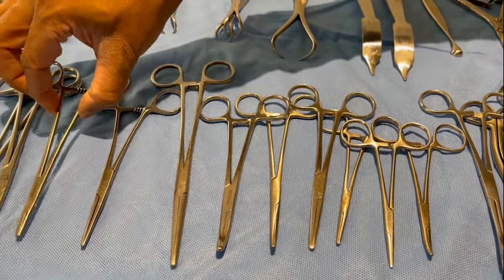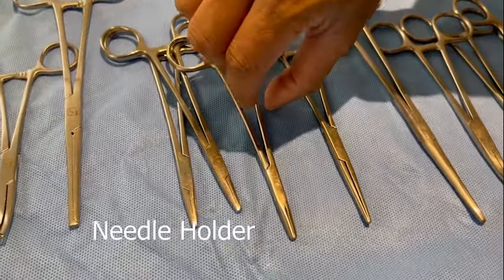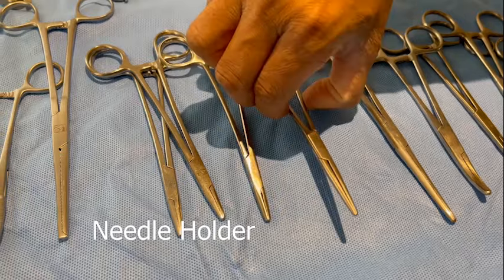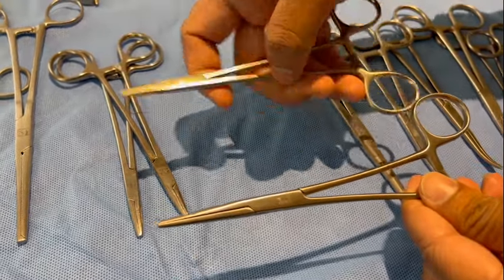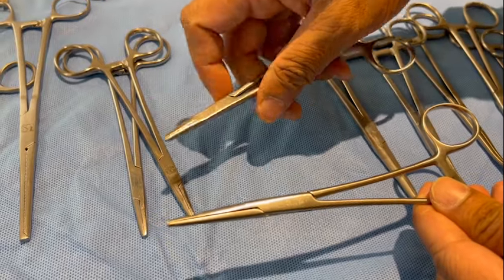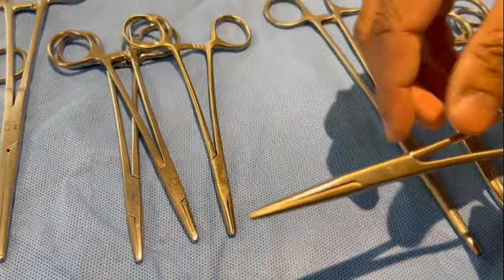Now we will go on to the needle holders. This is a needle holder. If you see the difference between the straight artery forceps and the needle holder, the needle holder is more stout and strong in order to be able to manipulate the needle into the tissues.